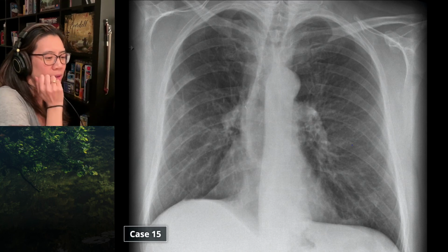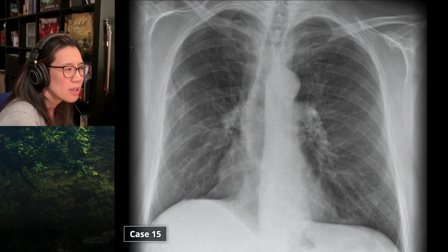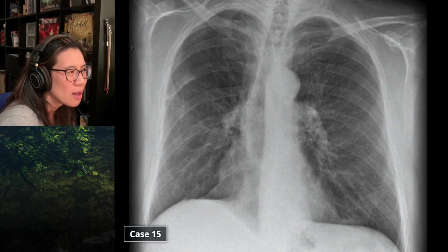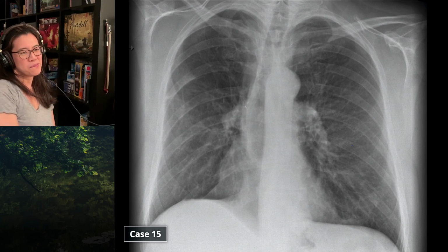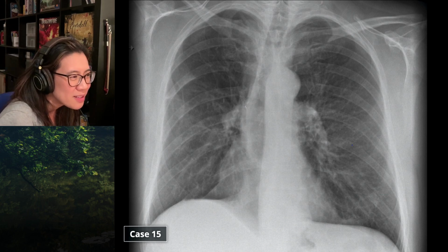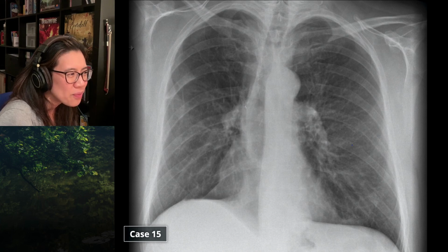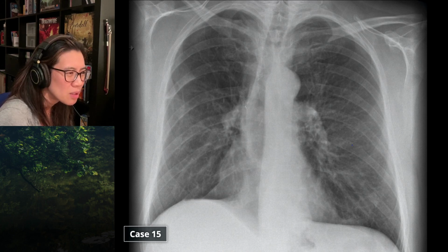Okay. So frontal chest radiograph, an adult patient, demonstrating surgical clips and loss of right lung volume in keeping with the history of surgery. Oh, I forgot to put the Harlequin here to remind you what we're talking about. So I think there's a Harlequin between the right upper lung and the right lower lung. The right upper lung is relatively lucent compared to the right lower lung. Relatively lucent compared to the rest. Yes. Correct.